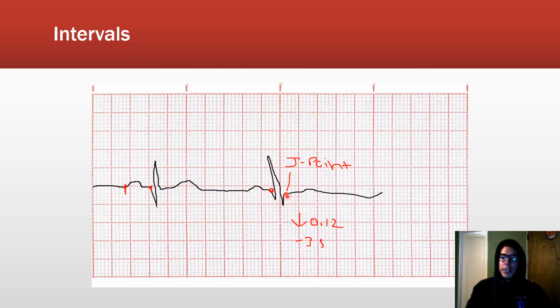Then, really the only other one we have is a QT interval, which some measure from the start of the Q wave, which I guess is right, or some, I think, measure it from the R wave, I don't know, but basically from the start of the QRS to somewhere after the T wave. It's actually really tricky to tell, and your monitor will tell for you. On the paper of a 12 lead, it'll say what the QT is and what it should be, because it varies from person to person on things that are way beyond me and way beyond basically anyone except a computer.